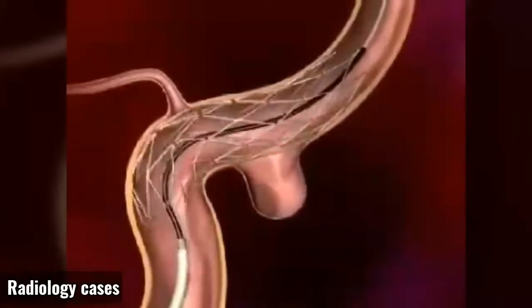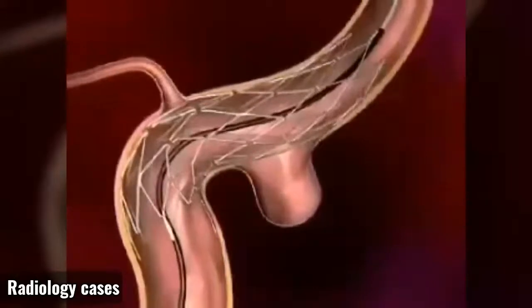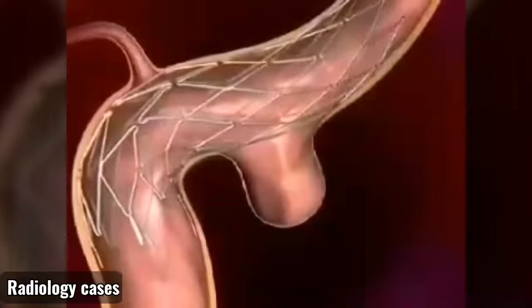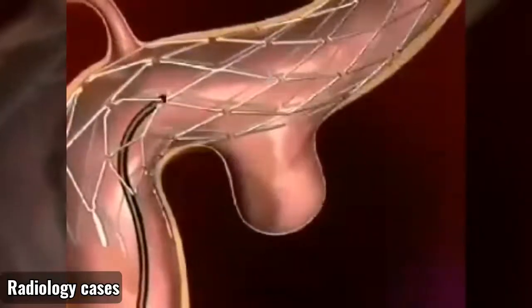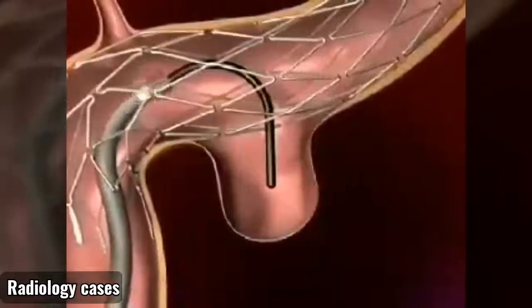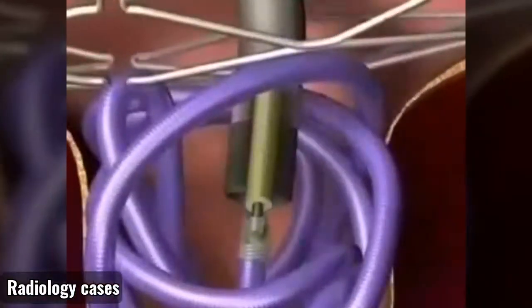Endovascular coiling is also usually carried out under general anesthetic. The procedure involves inserting a thin tube called a catheter into an artery in your leg or groin. The tube is guided through the network of blood vessels, up into your head and finally into the aneurysm. Tiny platinum coils are then passed through the tube into the aneurysm. Once the aneurysm is full of coils, blood cannot enter it. This means the aneurysm is sealed off from the main artery, which prevents it growing or rupturing.